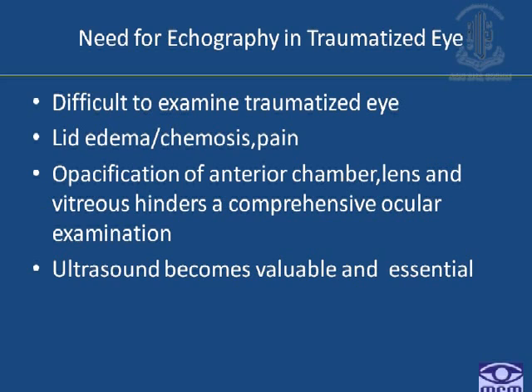You can ask me a very simple and logical question: why would you like to do an ecography in a traumatized eye? The answer is also very simple. In a traumatized eye, when the patient comes to the OPD or your clinic or in your practice, it is very difficult to examine the patient because of the severe lid edema he is carrying, chemosis of the eye, and the patient is definitely symptomatic.